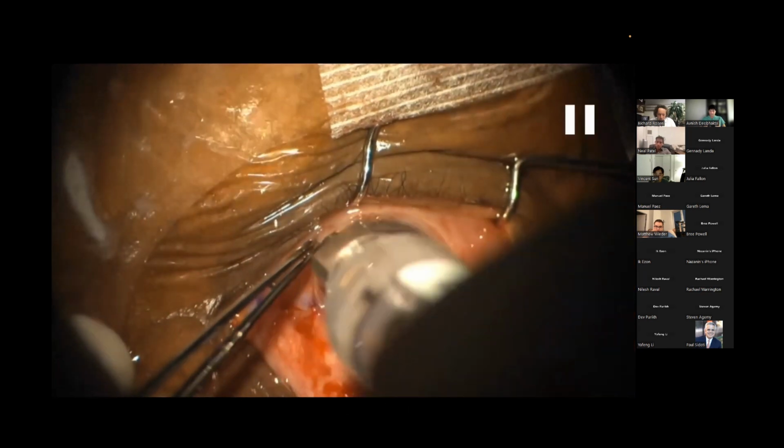Neal, one more point here. Again, what Dr. Rosen mentioned, that in this case it was the first attempt: let's try to wash it with BSS. We were lucky in this case, but usually as soon as the pass is on, the gas will try to come forward. Luckily it didn't, but the next stage would be to use what Dr. Rosen said, viscoelastic, to try to push it back, because sometimes it's not that successful. So let me ask the audience and Dr. Rosen, let's say you try with viscoelastic and you still see the gas coming forward. What next step, Dr. Rosen?